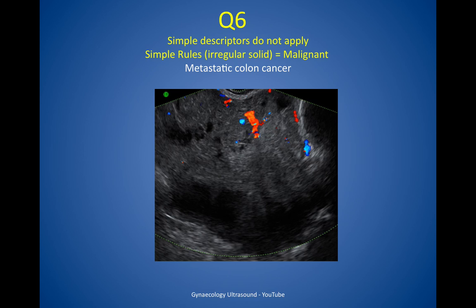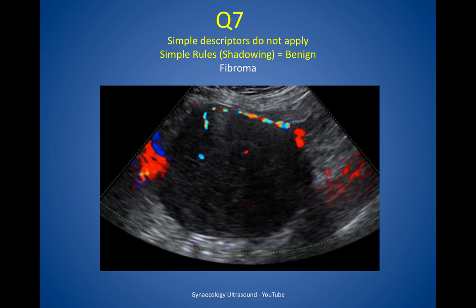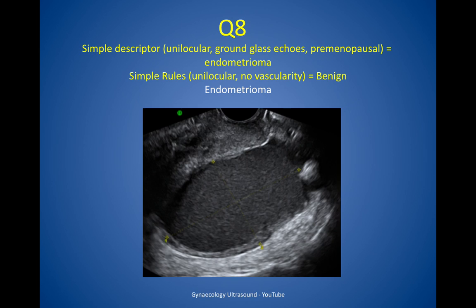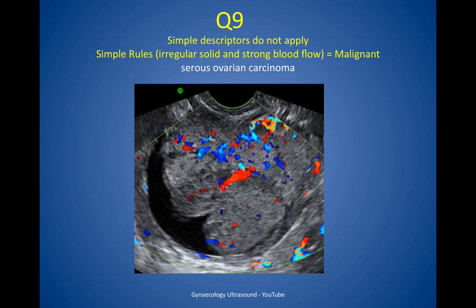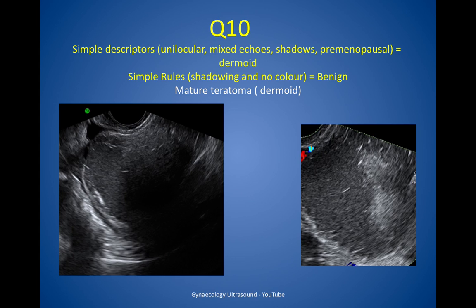Question 6: simple descriptors do not apply but on simple rules it's irregular and solid — malignant — and this was metastatic colon cancer. Question 7: simple descriptors do not apply but on simple rules there was shadowing — a benign feature — and this was a fibroma. Question 8: on simple descriptors this is unilocular with ground glass echogenicity in a pre-menopausal woman — an endometrioma. On simple rules it was unilocular with no vascularity, so benign — this was an endometrioma. Question 9: simple descriptors do not apply but on simple rules it's an irregular solid lesion with strong blood flow — malignant — this was a serous ovarian carcinoma. Question 10: on simple descriptors this is a unilocular lesion with mixed echogenicity and shadowing in a pre-menopausal woman — a dermoid. On simple rules there's shadowing and no colour flow, so it looks benign — this was a mature teratoma or dermoid.